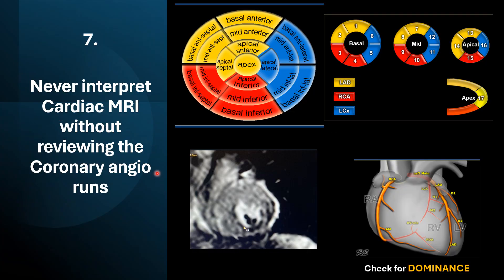Whenever interpreting cardiac MRI, review the coronary angiography images. In our patient, areas of mid inferior and basal inferior segments showed perfusion defects. Traditionally we might interpret this as RCA territory, but the coronary images showed the RCA was hypoplastic and not supplying the PDA — it was the LCX supplying the mid inferior and basal inferior segments. Don't blindly write this as RCA territory; check for dominance and review coronary images before submitting your report.